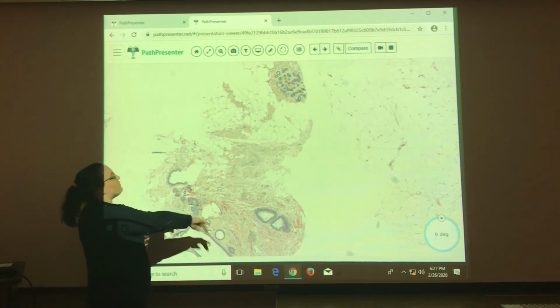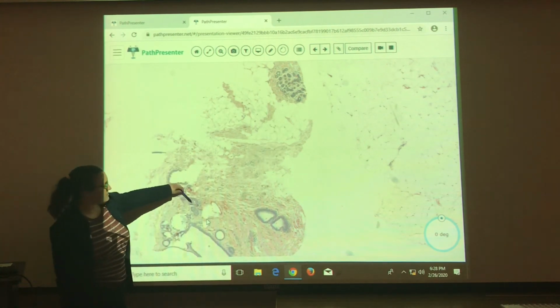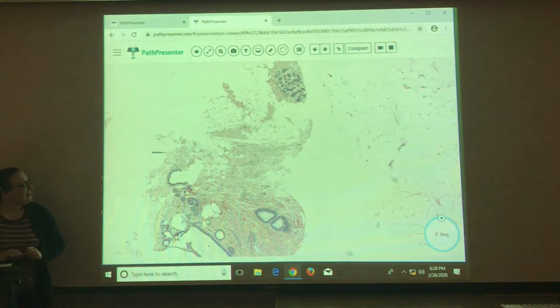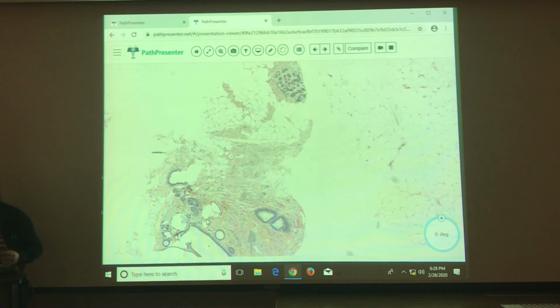This is a perfect view. So you see, we have our normal up there, right? Yeah. And you compare it to this. This is expanded. You guys don't get to argue with me that that's not expanded. Okay, so there's your lesion and ALH, because you guys know I go in patterns.